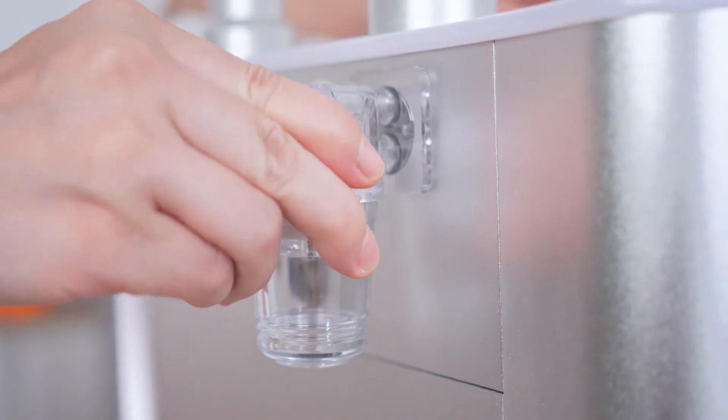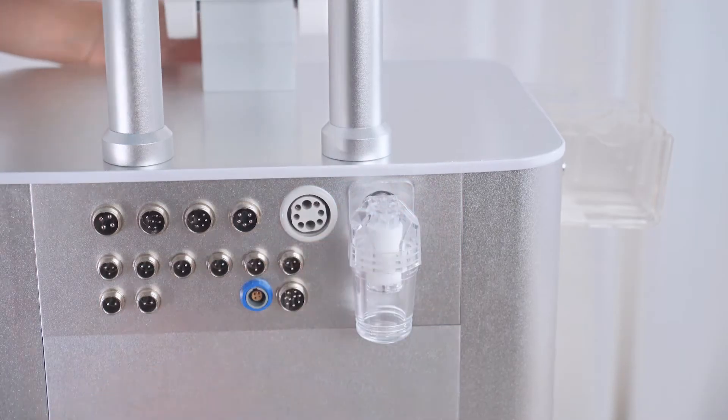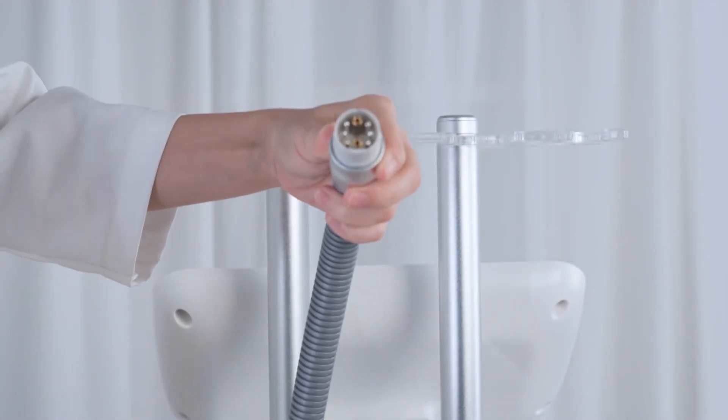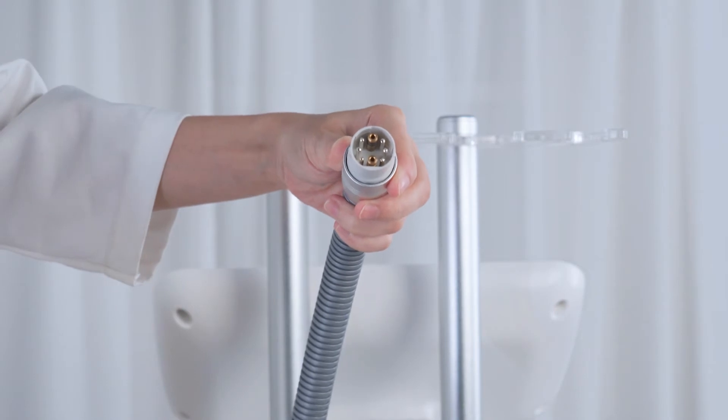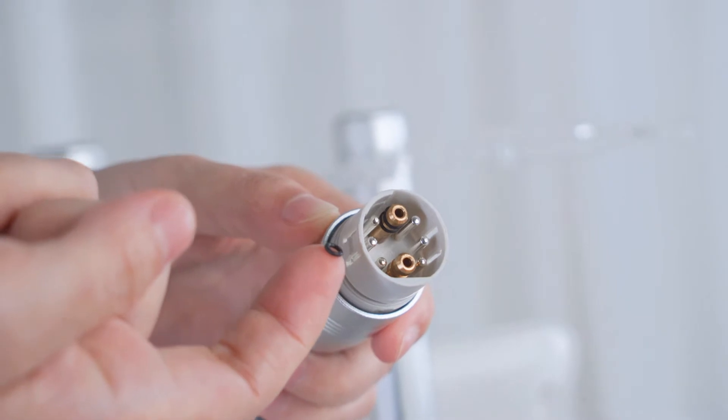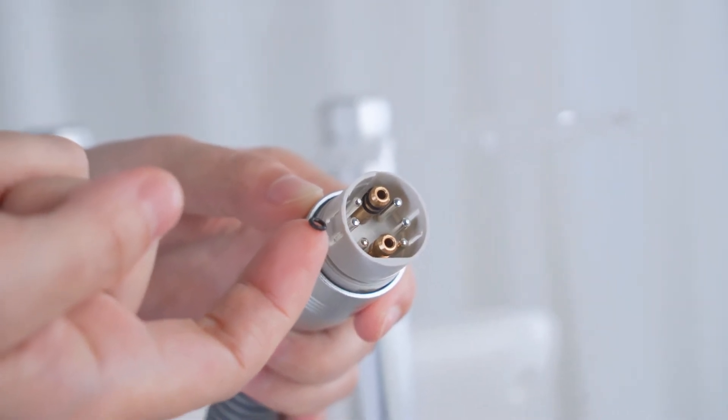Insert the filter in the correct direction to ensure proper function. There is a big spare rubber ring in the accessory bag for the RF handle. When the RF handle has no suction because of the rubber ring, replace it before operation.